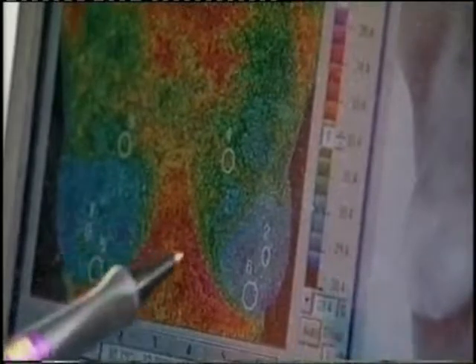Do you have any pictures on your laptop there? I do. Of a positive? The one that's on my laptop right now is a picture of a normal scan. So this is a woman who has a normal thermogram, normal breasts. And I also have a picture once. Yes. So here we are. What we're looking at, obviously right and left breast, you can see generally the breasts look quite blue and cool. That's usually a good sign. It means that there's no abnormal heat activity.